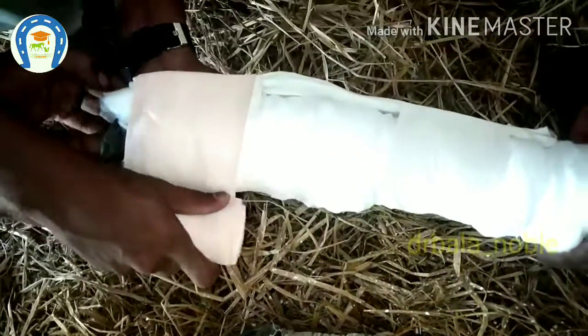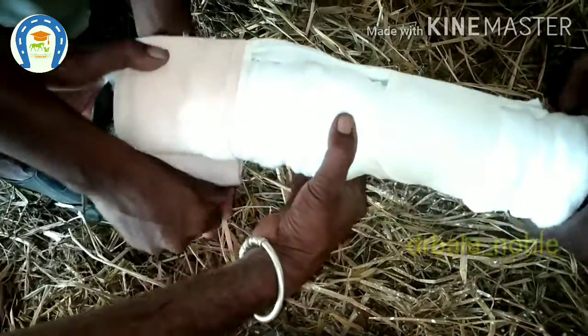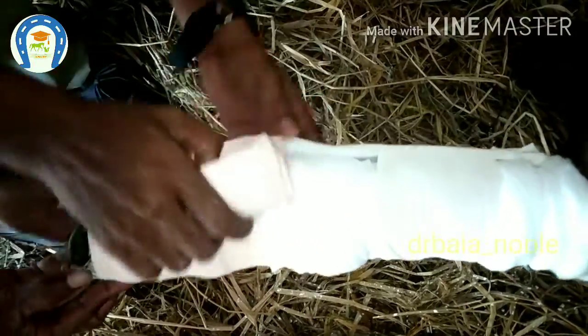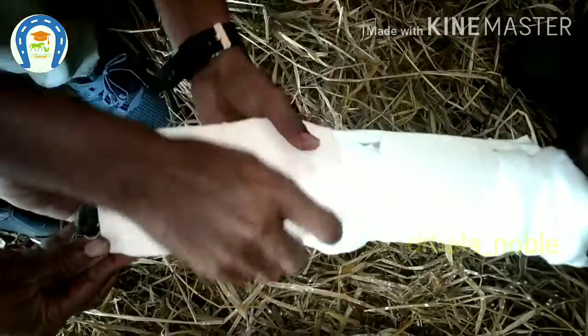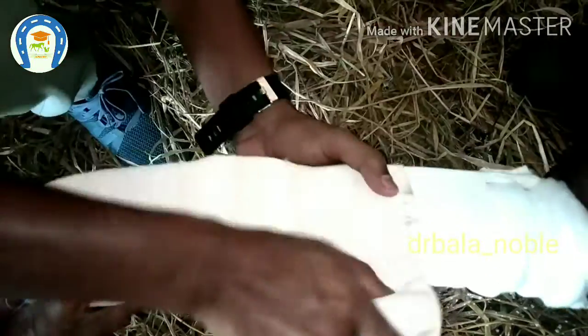Just for extra support, applying the grip bandage. Animals will not cooperate in most orthopedic cases because of the pain, so it is better to sedate or even anesthetize the animal for a better result.